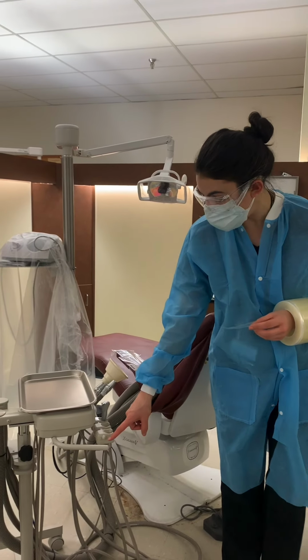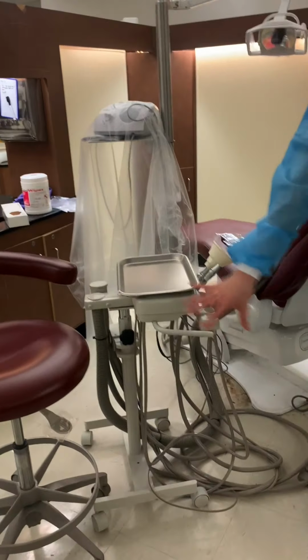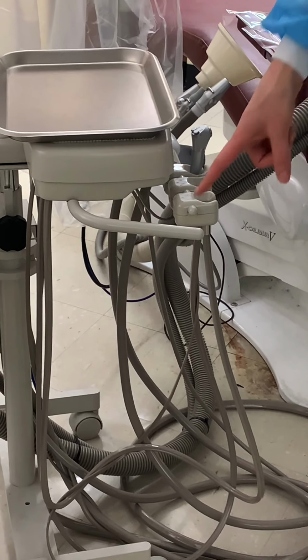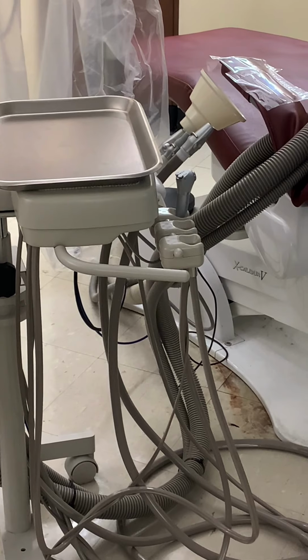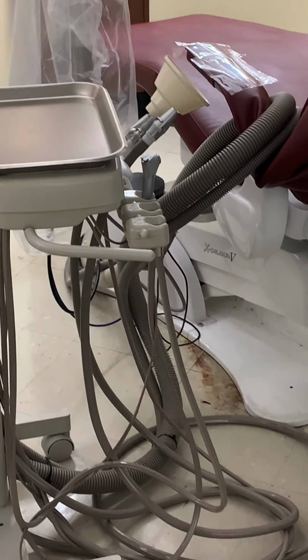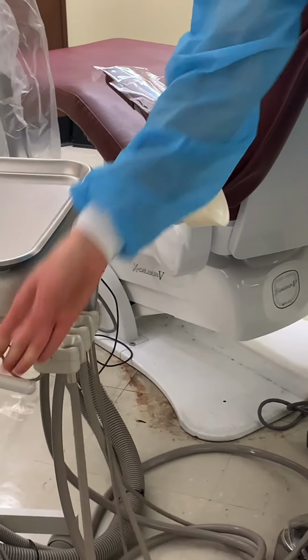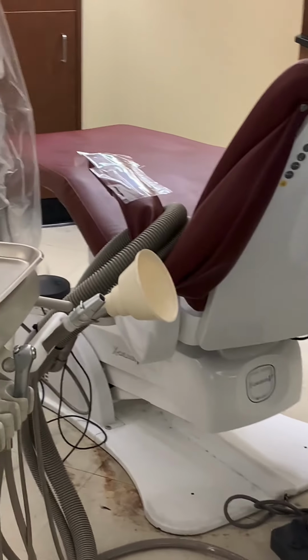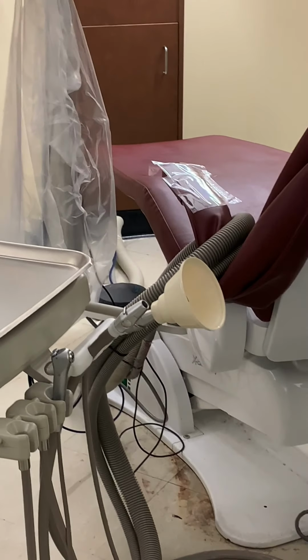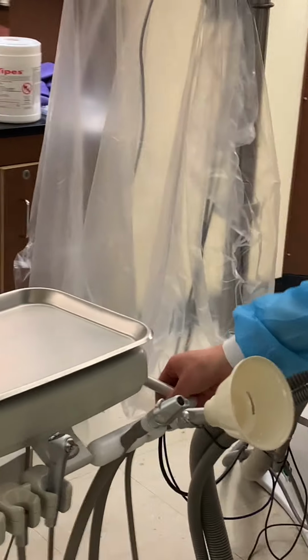The next thing to use barrier tape for is the handle on the delivery unit. This whole thing is called the delivery unit. That's something that a lot of people touch. And of course we wouldn't grab here if there's sharp instruments or something, so we're going to put a little barrier on here too. And again, let's put it bilaterally because what if you're grabbing it? And then what if the dentist is grabbing it too? So you and the operator might want to grab it. So it should be barriered bilaterally on here.